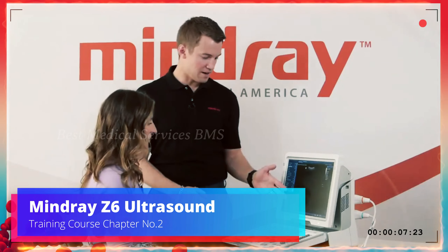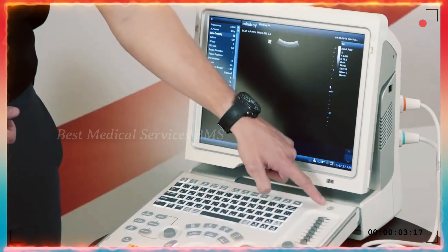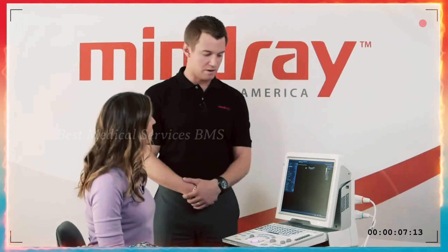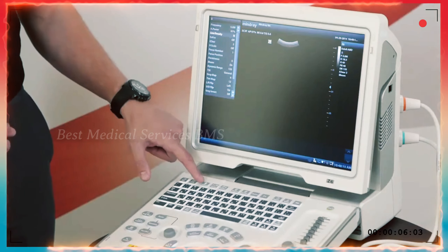Now that we're looking at the machine and ready to start imaging, we have everything set up. Look to the top right of the keyboard for the power button. You don't have to press and hold — just press the power button and it'll boot up. It only takes about 28 seconds to get to the imaging screen. At that point, you're ready for step one, which is your patient information.